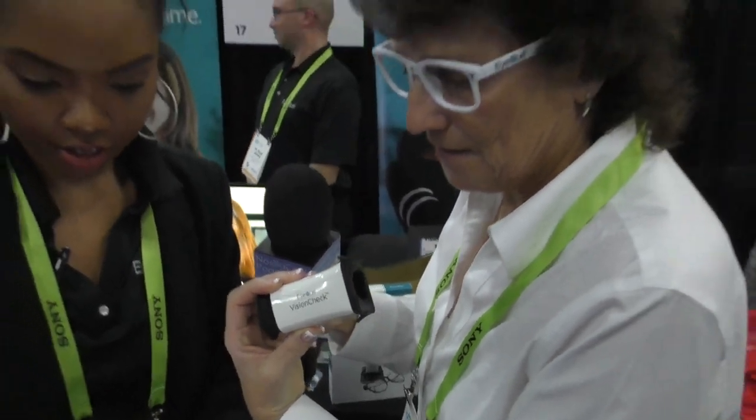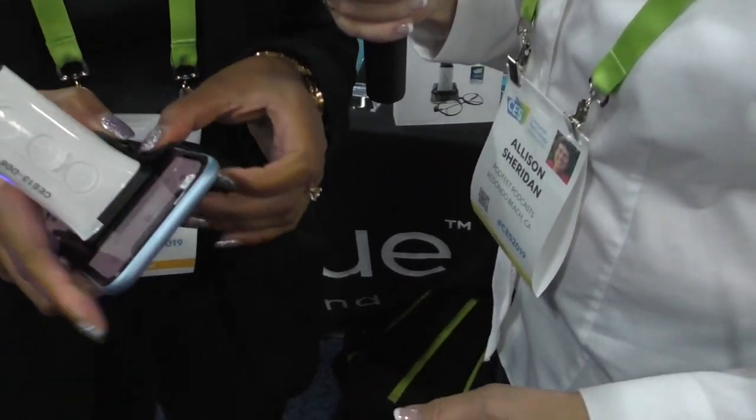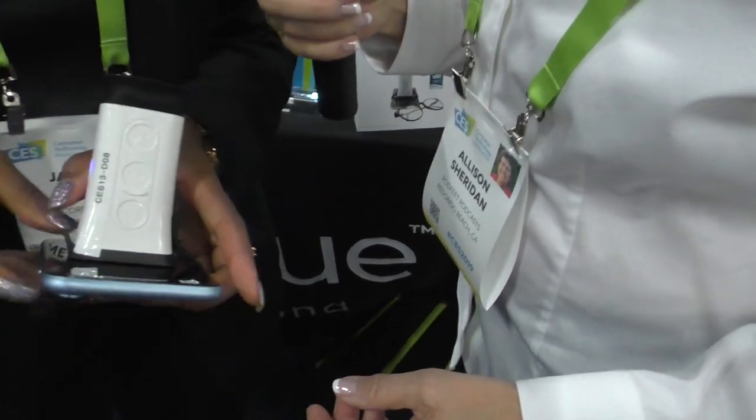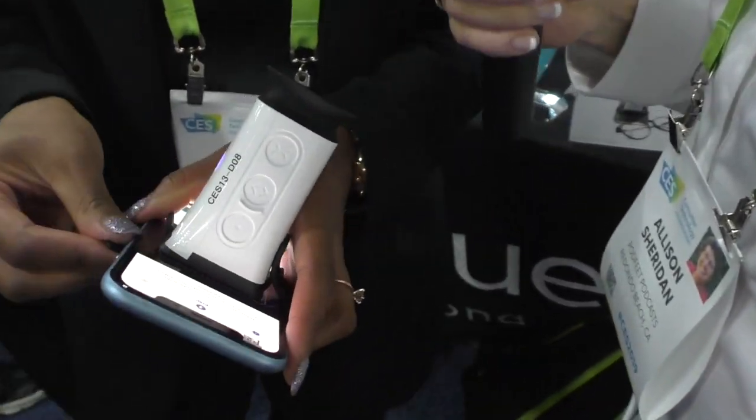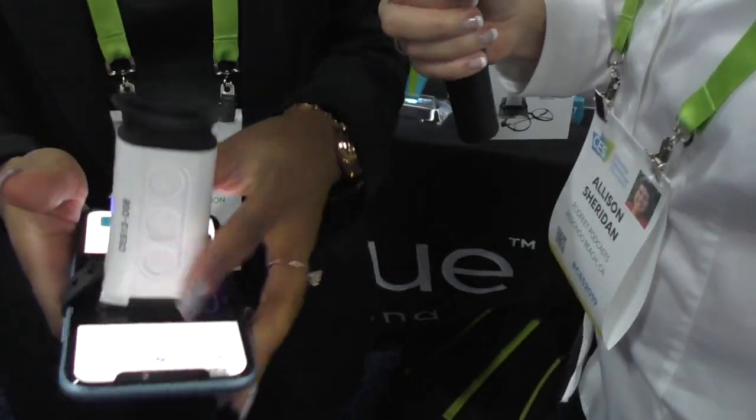I'm holding it up for the camera while she gets the phone going. Is this actually going to check your prescription? Yes — it's going to give you your refractive error, which is what you need to order glasses online. She's got the app up and she's attaching this thing onto the screen — it's got a little rubber gasket that wraps around it, which will cover the screen so you won't be able to use Face ID or the buttons.